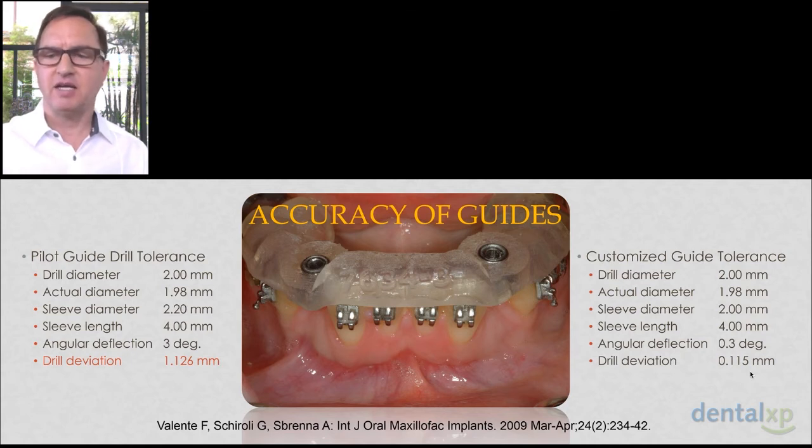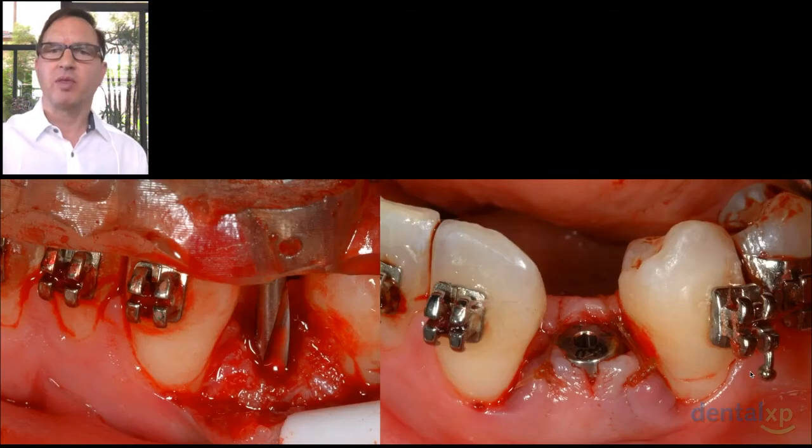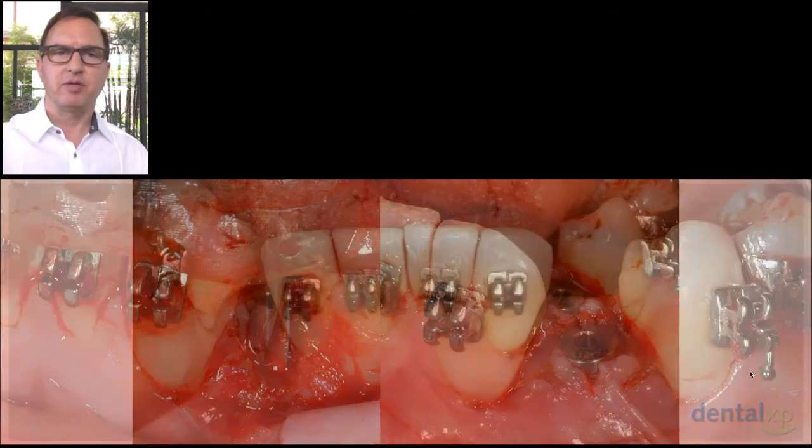And as I often say, it's important, as Reagan mentioned, to trust but verify. So as we're performing this treatment, verification radiographs were taken midway through the procedure. So what we learned is if we indicate that we're using a 2 millimeter drill, we'll get an oversized sleeve for tolerance. But if we tell them we're using a 1.9 millimeter drill, then the pilot guide comes back with a 2 millimeter sleeve. The Dentsply implant's 2 millimeter burr is actually 1.98 and fits perfectly in there. And utilizing that approach, we're able to manage the space and predictably accomplish this task.